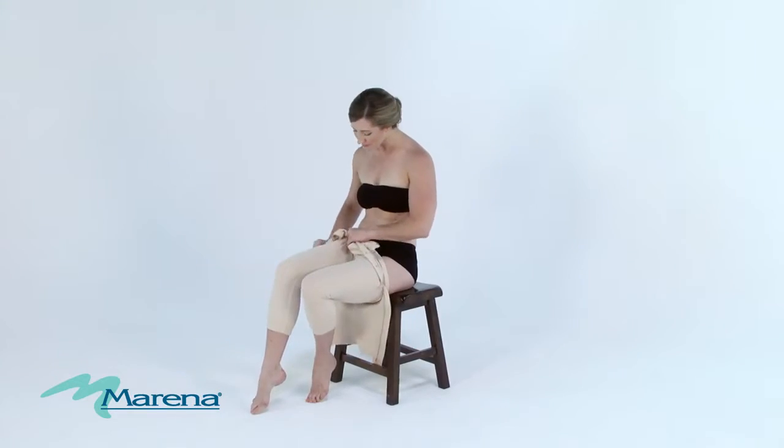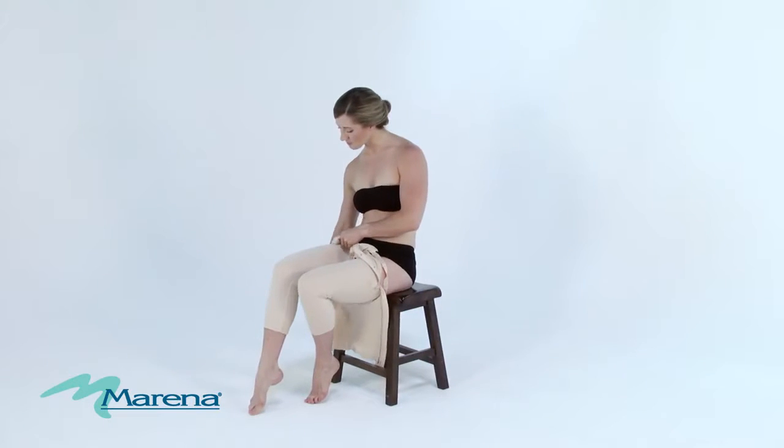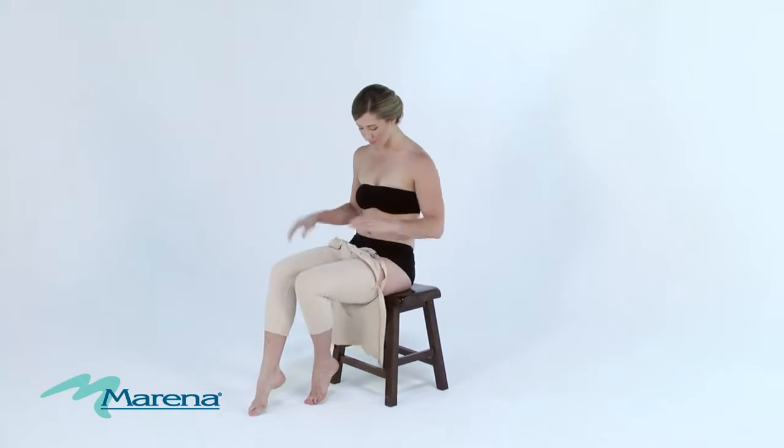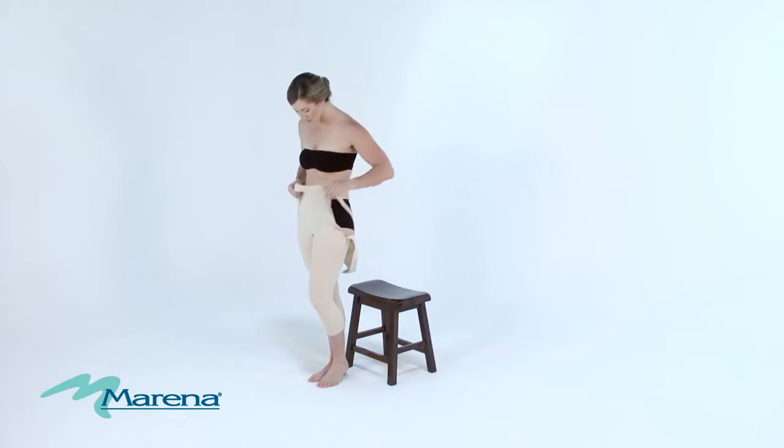It's important to be extra careful and mindful of your fingernails while putting on your compression garment in order not to damage the fabric. Once the garment is around your hips, adjust the fit of the inseam.